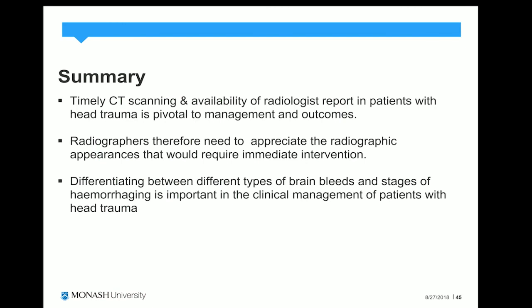So in summary then, it's really important that when a patient is referred for a CT scan, the patient is scanned as soon as possible. So the first available slot, the patient needs to be scanned, and then there should be a radiologist available to provide a report, as timely management is pivotal to the outcome and the management of the patients.